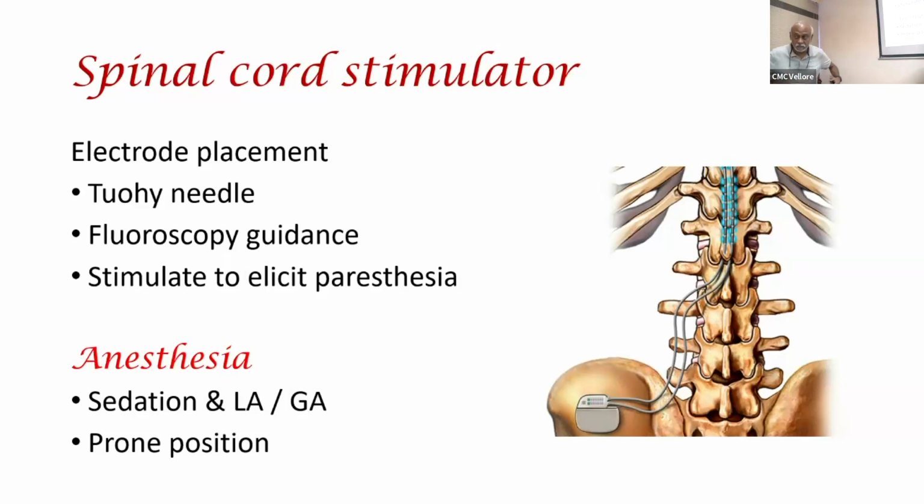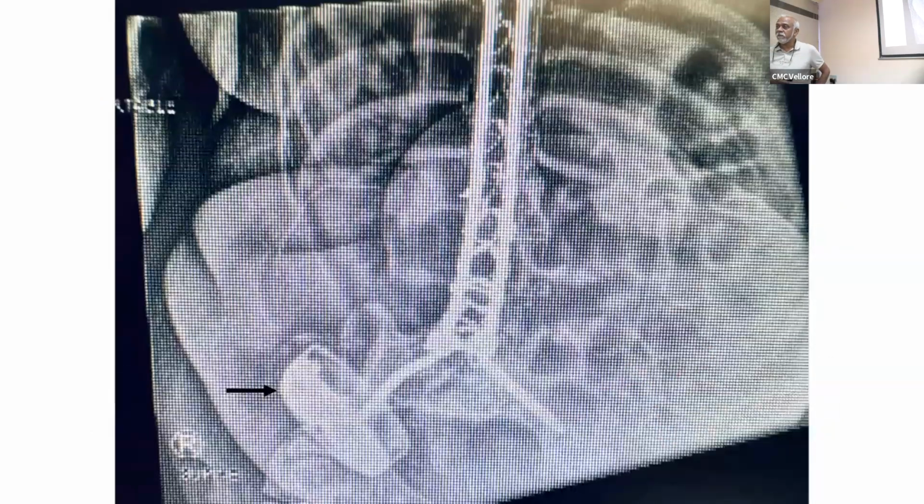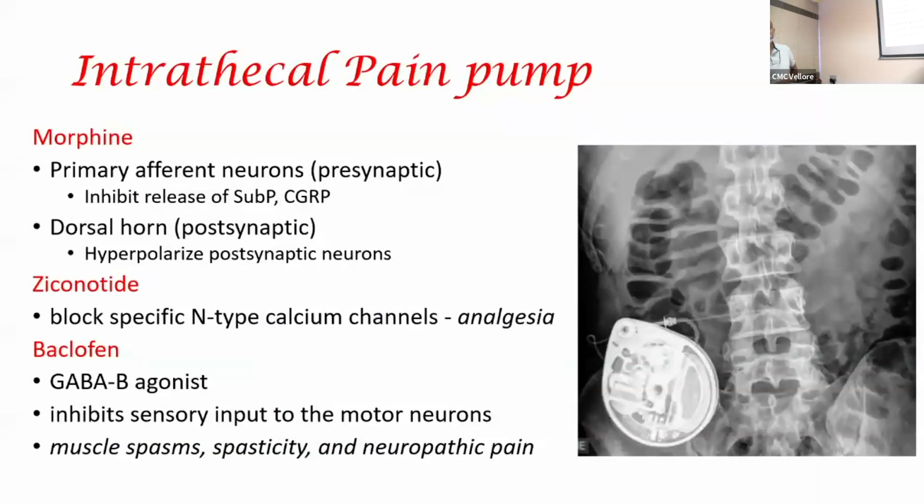But remember, it's in prone position there to get at the back. Usually a fluoroscopic guidance. You may have seen this. This is an intrathecal pain pump.